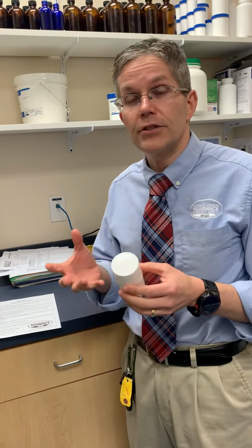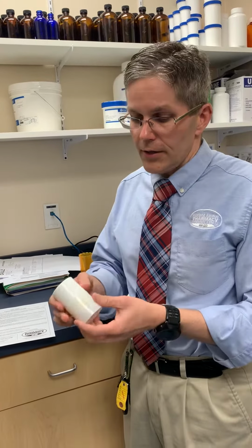Wanted to take time to demonstrate an MD pump, MD meaning multi-dose pump, that we typically use to dispense pain creams in. Oftentimes it might have testosterone as well for men. These pumps can deliver either 0.5 mLs or sometimes a 1 ml dose per time that you pump it. So again, it's a little pump.